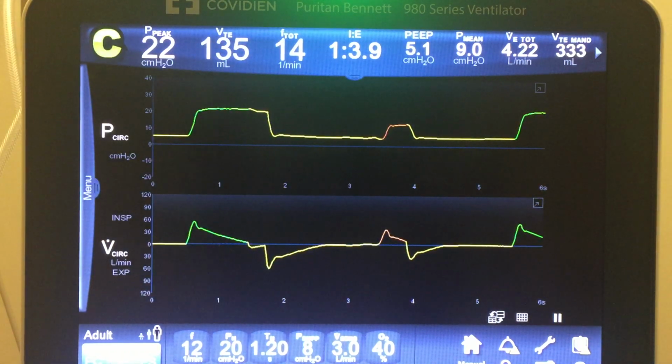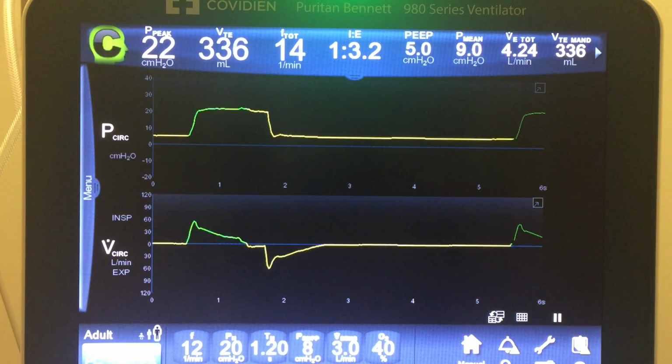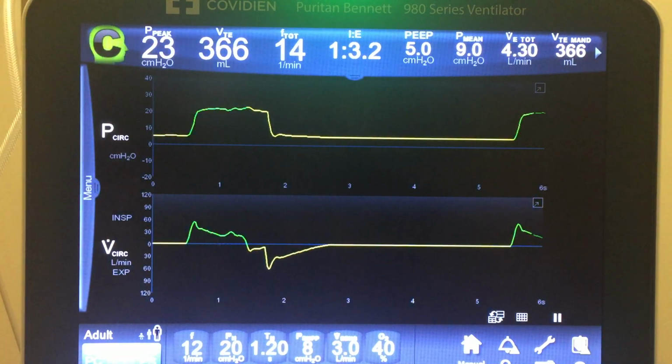Okay? If it's at PEEP high, I'm going to see if I can catch one during PEEP high here. Hold on. You get one in the middle of the screen. Okay, notice there wasn't an extra 8 piled on top of that. Pressure support is only from PEEP low.